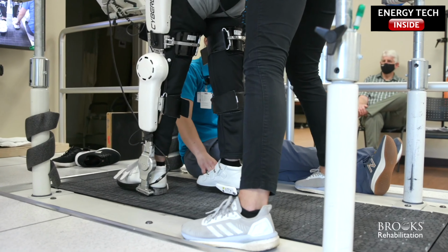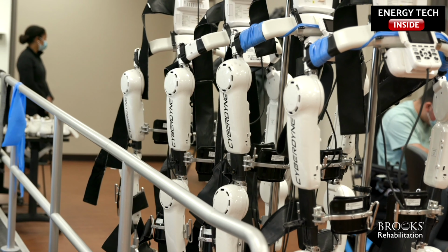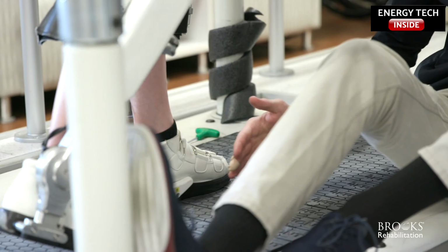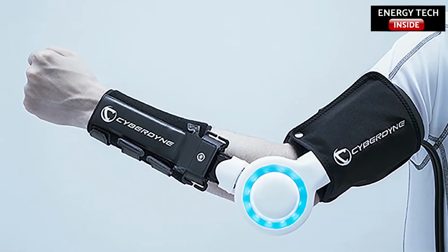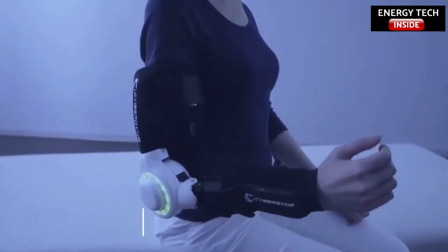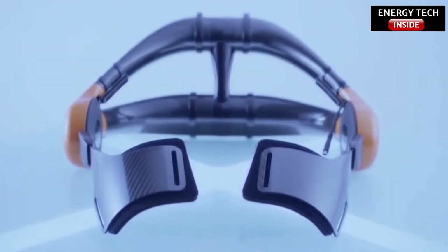According to a video by Brooks Rehabilitation, HAL can multitask, serving as both a physical therapy exoskeleton and also one to aid healthcare workers. According to Cyberdyne's product page, the battery-operated HAL lumbar type for labor support exoskeleton is designed to provide lumbar support when users are lifting and moving items or people, such as nurses moving patients or seniors seeking physical therapy, getting assistance when sitting down or standing up.